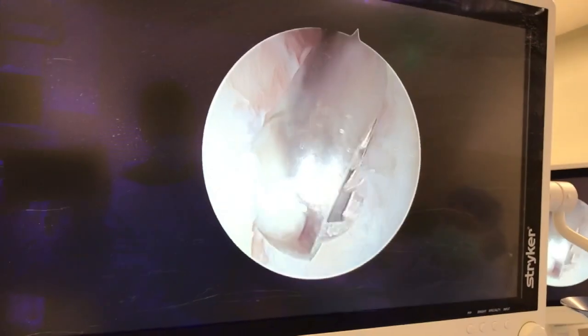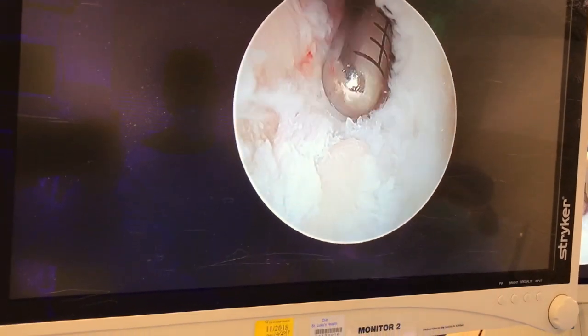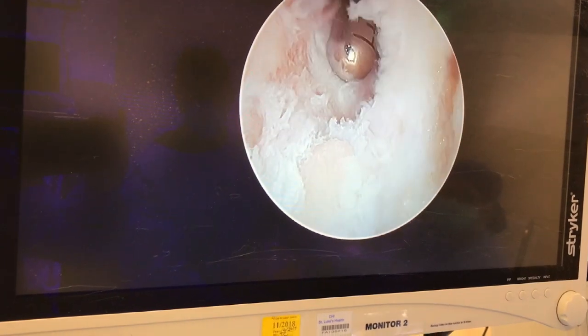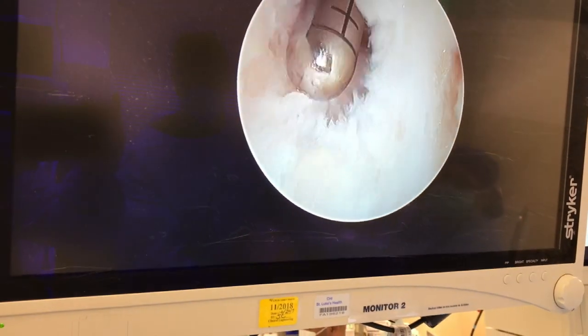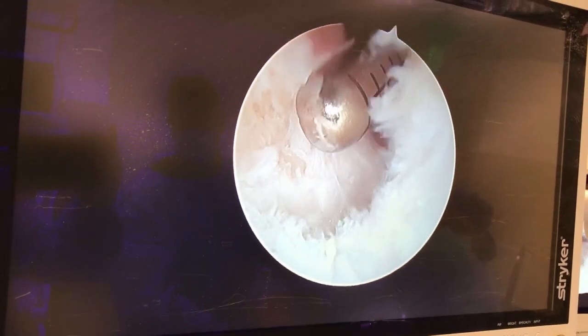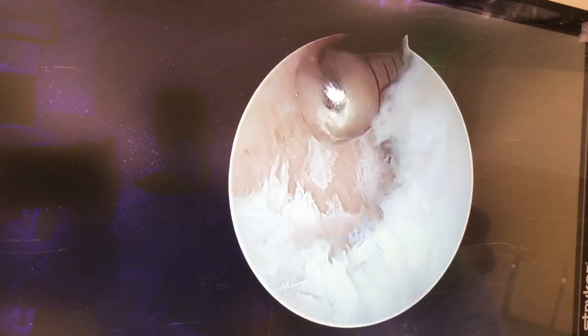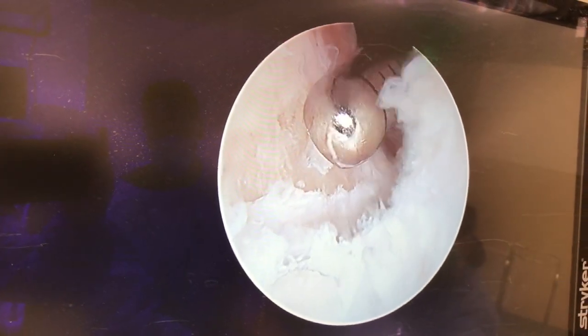This is the front of the talus, and she's got some damage right here. A little bit of bleeding. Forward spin cleans up the cartilage damage. And if you look down here, we can see a little subchondral fracturing. That crumbly bone right there — or friable bone — is broken, and it's broken away so that cartilage has peeled away.